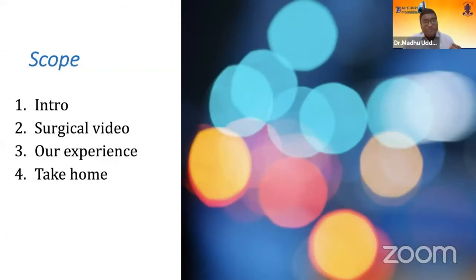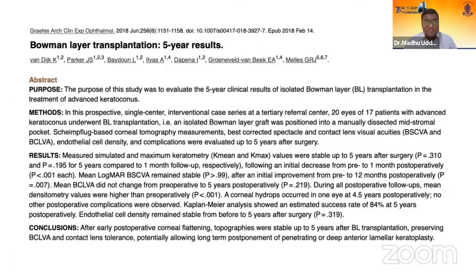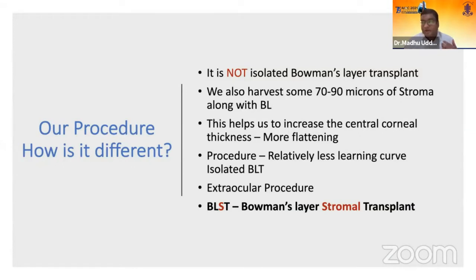The scope of this talk would be under the following headings. Bowman's layer transplantation is not something new. It has already been done by Professor Melles for many years, and there are several publications that he has already published. We had already gone through this review of literature, and these are his 5-year results of Bowman layer transplantation. From this, we tried to do it in our own way by modifying his technique a bit.